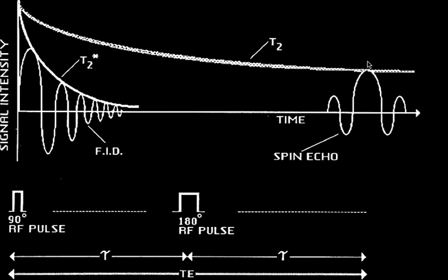That is irreversibly lost signal, and it's due to the fact that the magnetic field isn't constant, it's time varying. If the magnetic field were exactly constant throughout the entire experiment, before the 180-degree pulse and after the 180-degree pulse, then you'd get 100% rephasing, and the signal would go all the way up to the baseline state. So now, why is this important?